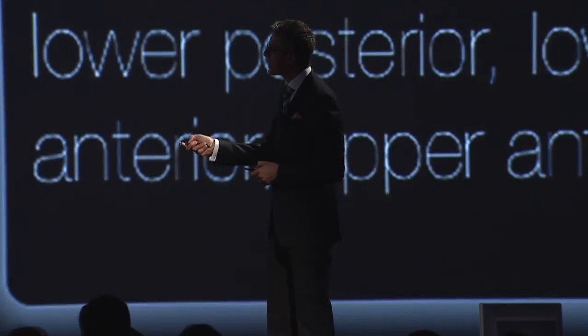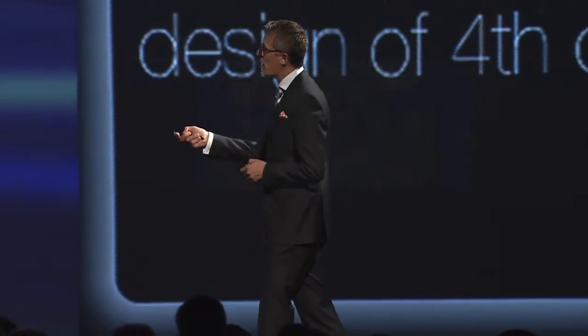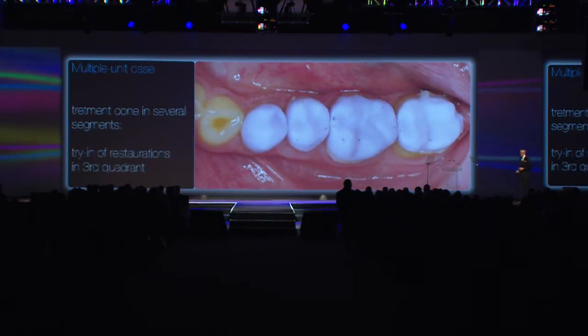So you see the CAD design of the restorations in the 4th quadrant. You see the buccal bite. You see, after elevating the bite, the CAD design of the 3rd quadrant here. And then after the machining of the Emax materials, I made a try-in.